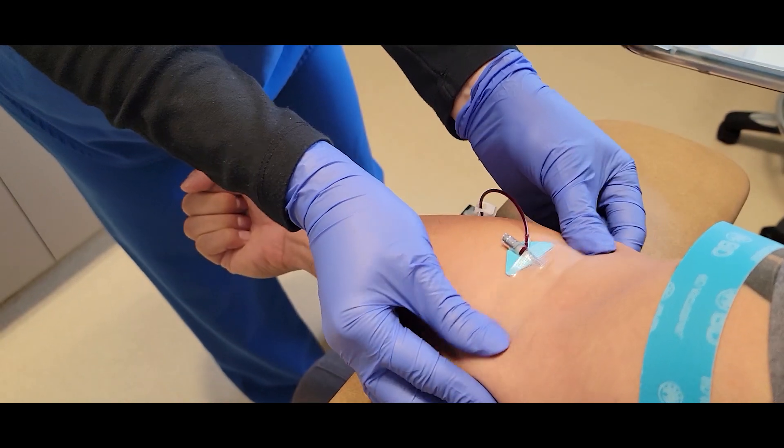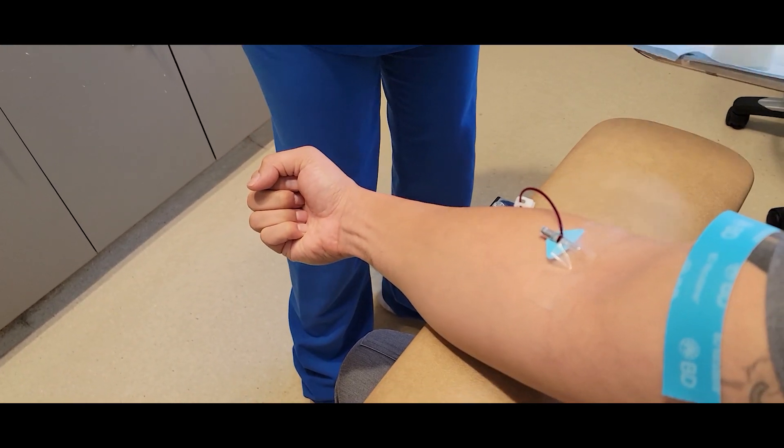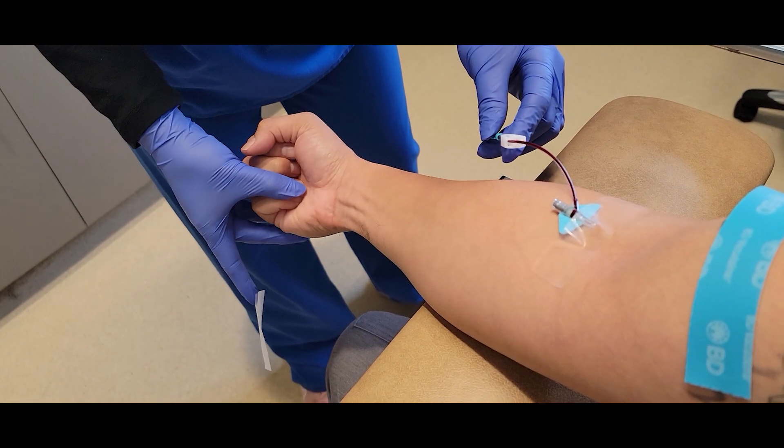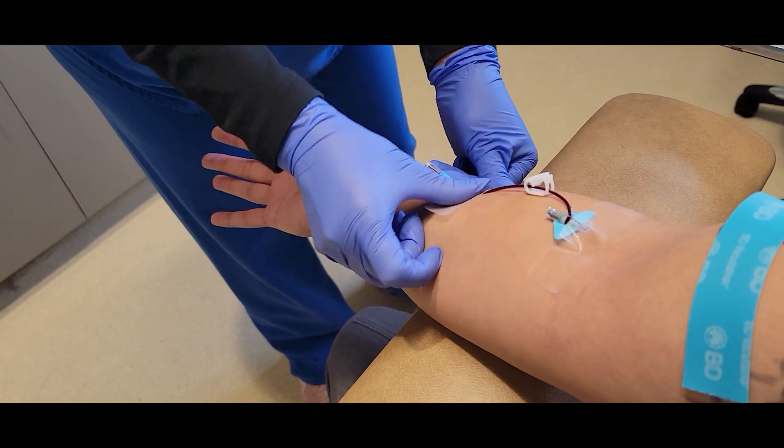And I'm going to tape that down up at the top. And since this one has a long tube, I'm going to tape it down also toward the bottom, and he is going to release his hand — he doesn't need to squeeze his fist anymore.